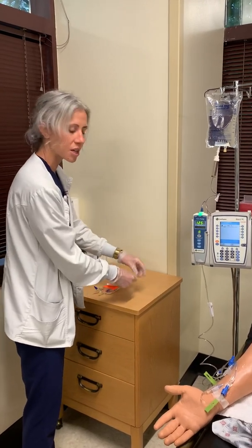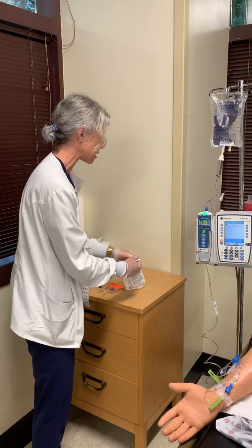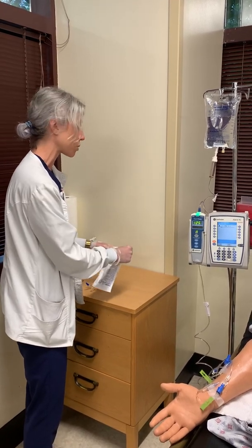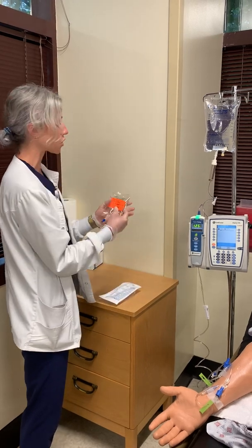I've already verified with him that he doesn't have any allergies, so I'm not worried about any interactions there. And I'm gonna go ahead and open up all my stuff. We're gonna be giving him an antibiotic, which we already talked about. So we're gonna give him some vancomycin. I verified that I've got the right dosage.